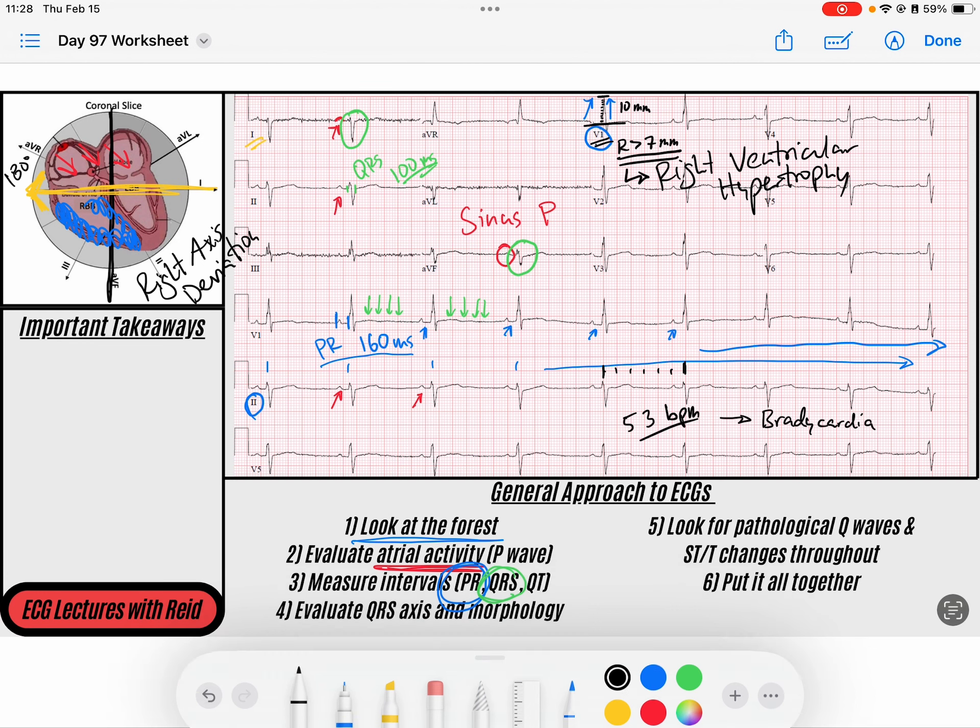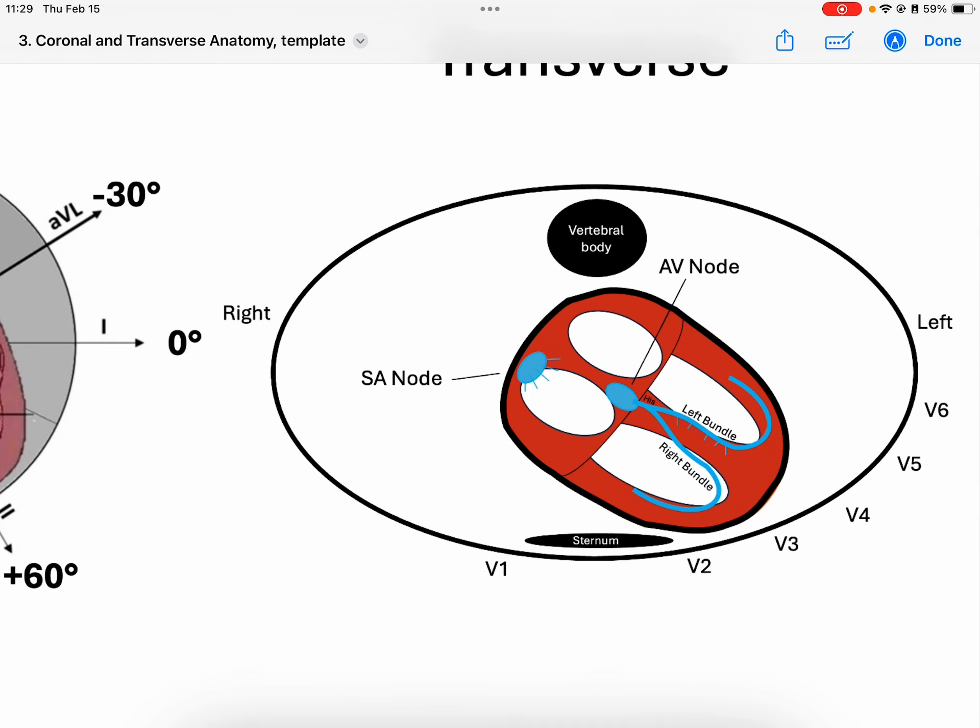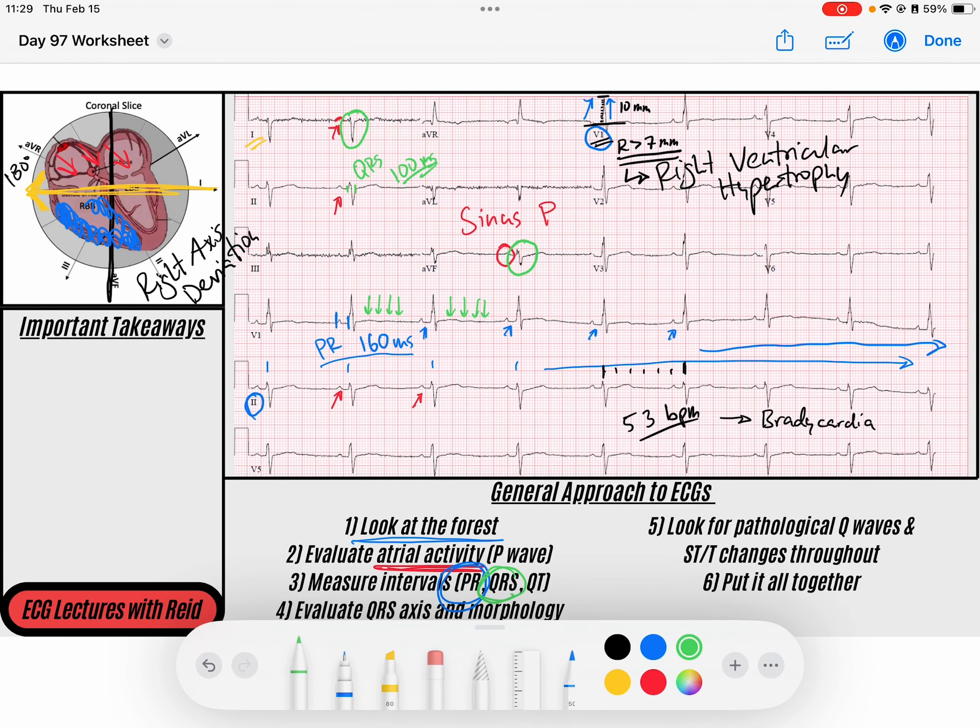And that makes sense. If we look at our transverse diagram of our precordial leads, you can see that my right ventricle, which is all this muscle right here, depolarization towards that muscle is mainly captured by this V1 lead and a little bit by V2, but more so V1. And so that's where we can measure if my right ventricle is hypertrophied. That explains our right axis deviation.